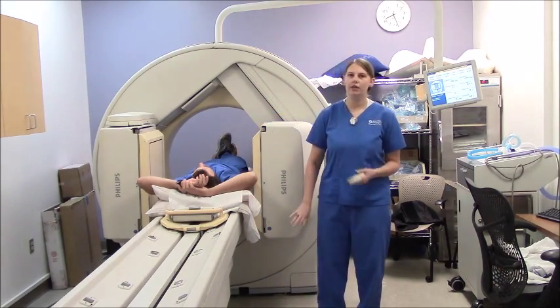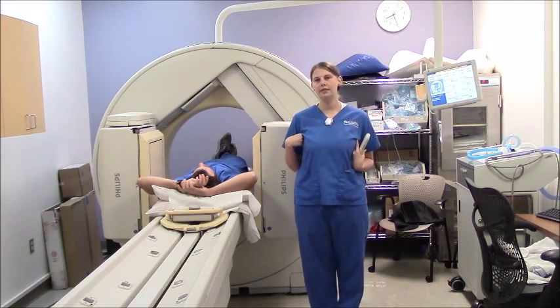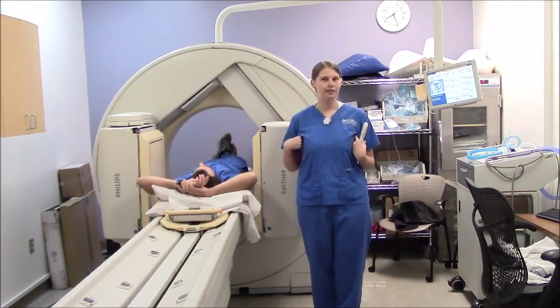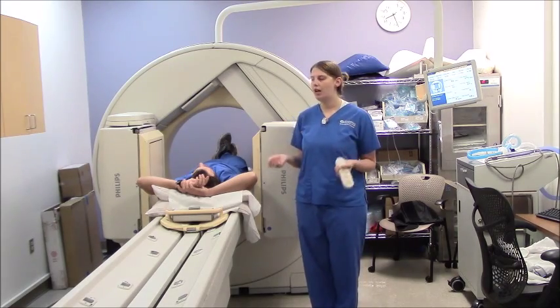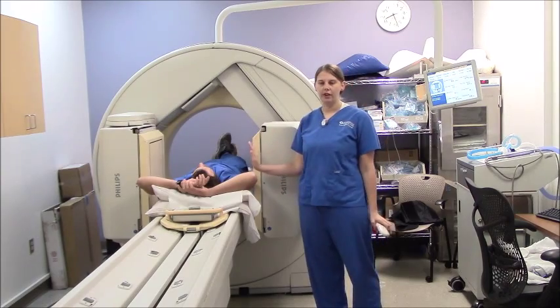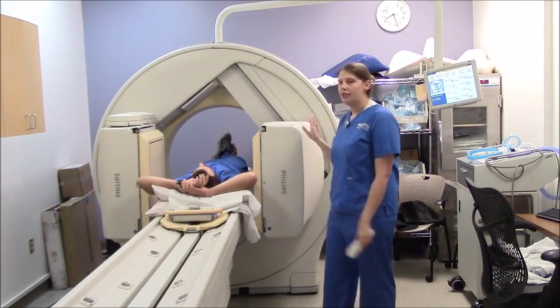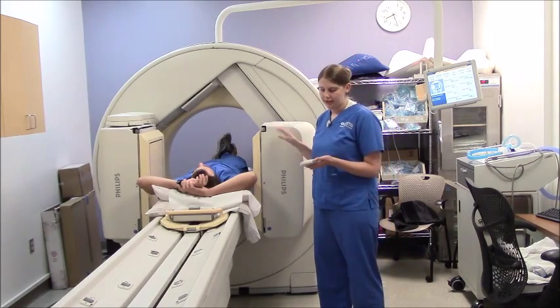So if we go a little more around the circle, now we can take lateral pictures of the lungs. Not every place will do lateral pictures, but some do. And again, you would move the camera heads in close to the patient and hit start. I'm going to show you the last view we will take.